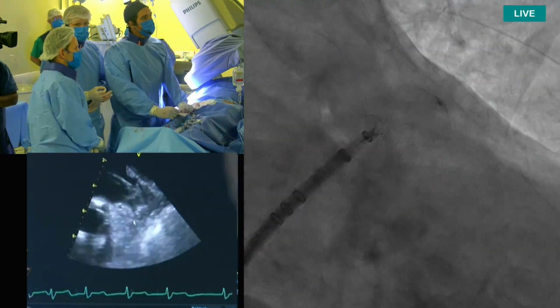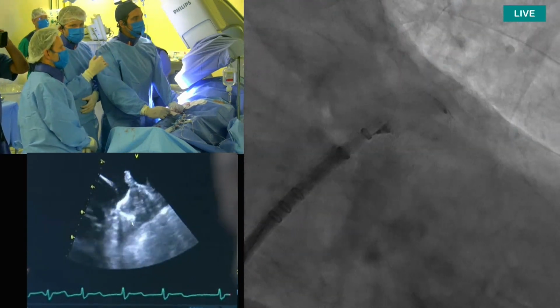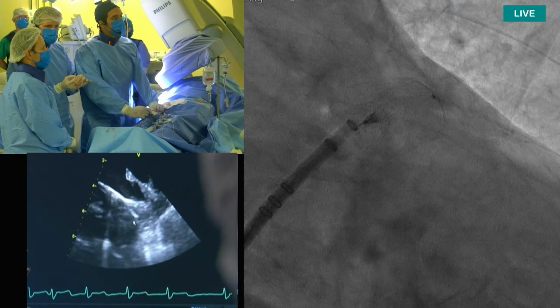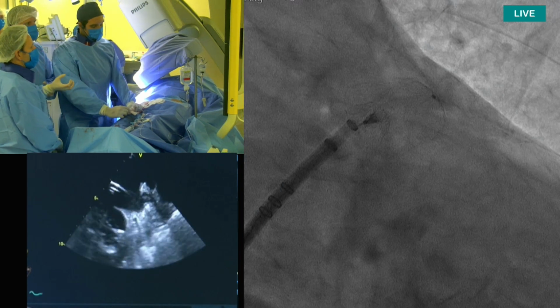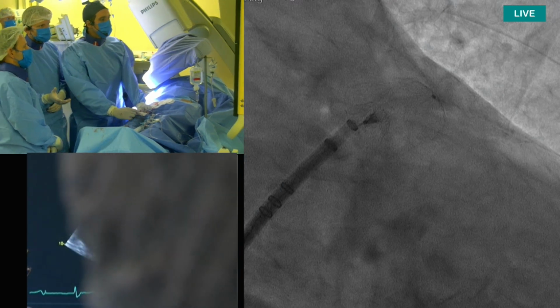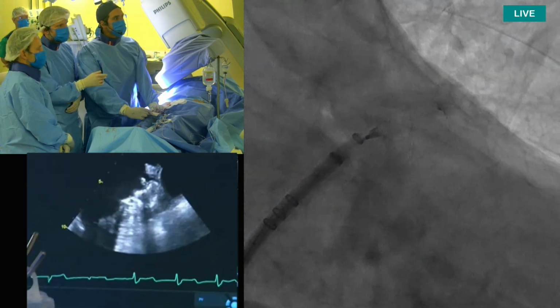So what Felipe indeed did, so we kept indeed in the beginning the ball in the distal lobe. That's just to keep the nice coaxiality. But then because he pushed only a little bit, but he pulled more back on the delivery sheath. So then we know that the device would come out of there. And this is actually beforehand, before we were doing the case, on the echo we were discussing, this was where we anticipated the device to come to sit.